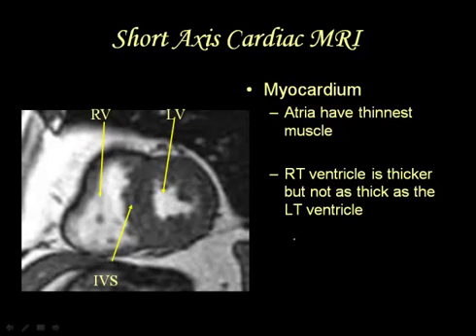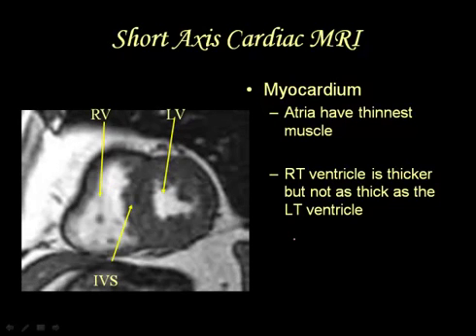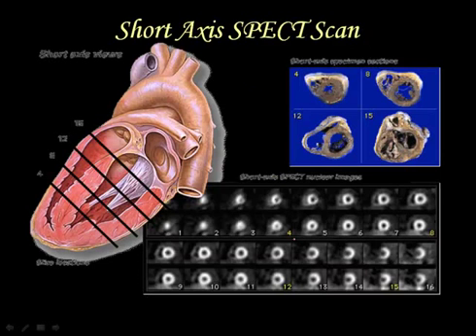Now, you can see the heart is beating, and that indeed is exactly what goes on. The whole point behind the contraction now is evaluating ejection fraction, and the efficiency of the left ventricle in pushing blood outward. So what you're looking at is at the point of dilation, the maximum amount of blood that's possible, and at the point of contraction, the maximum amount that has been pushed out. If you calculate the difference between them, that's how you come up with the ejection fraction.